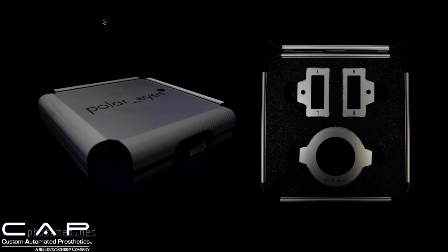And I love taking all sorts of pictures with these lenses just to get the different effect. And it's a lot of fun if you have any extracted teeth, you can set them up on your bench and take some pretty cool shots with those, and just really see all of the different effects and the colors and the chromas and the values that go into a natural tooth. And it's exciting, but it can actually be overwhelming as well, because obviously these are things that we're trying to mimic and copy in our restoration. But if you look at it as a learning tool as well as a practical tool for shade taking and the study of natural dentition, it's well worth it.